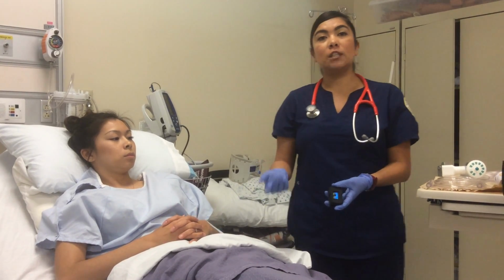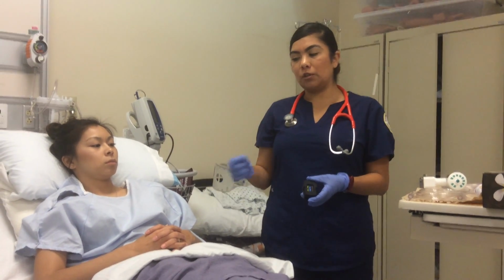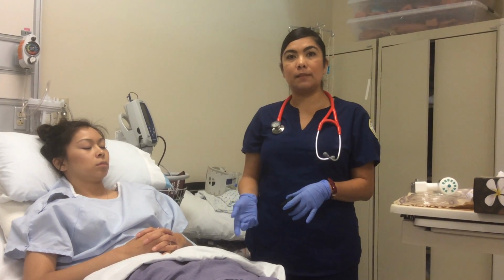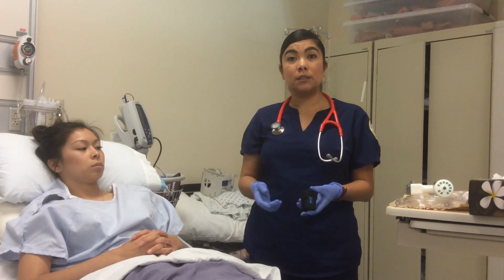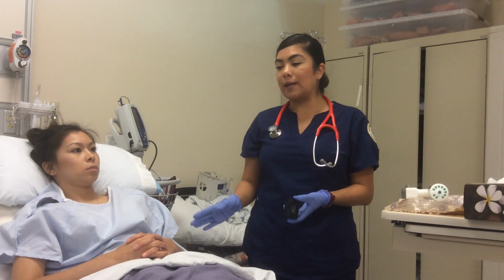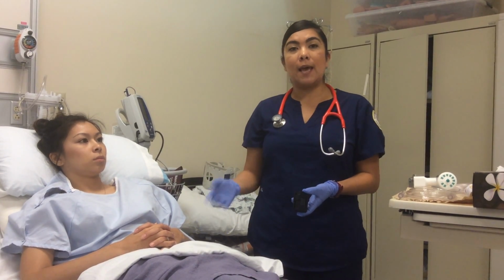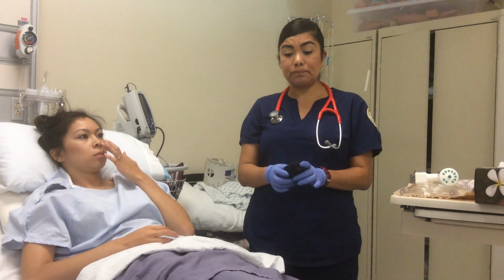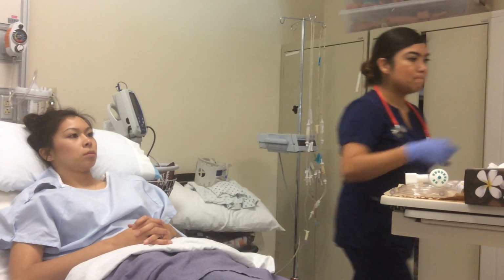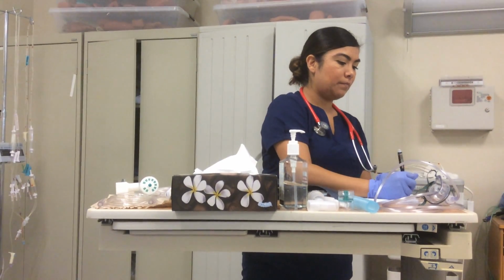So what I did is I checked it for a full minute. Actually, I checked her breath sounds for 30 seconds, and then I multiplied it by 2 since they were normal, and then I did the same thing with her pulse. I checked it for 30 seconds, and then multiplied that by 2. So right now her breath sounds, I received 13 breaths per minute, and for her pulse it was 72 beats per minute. You want to make sure you check their saturation levels during treatment, to see if it goes down or goes up.